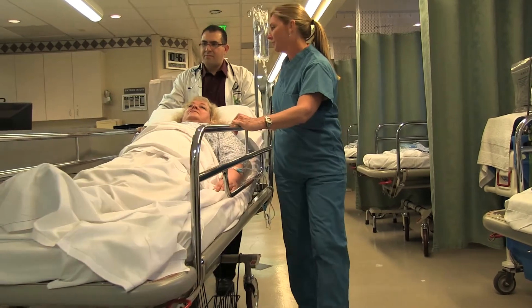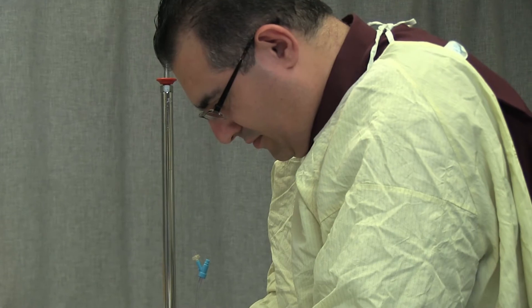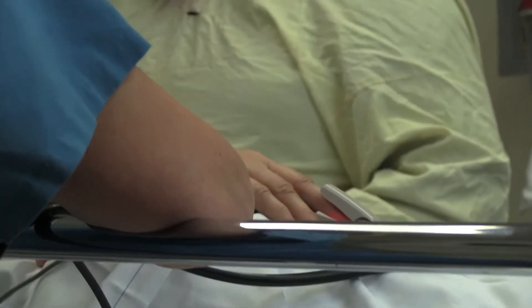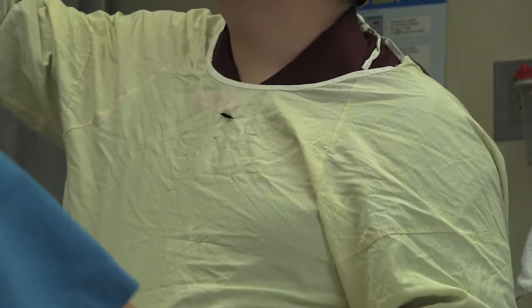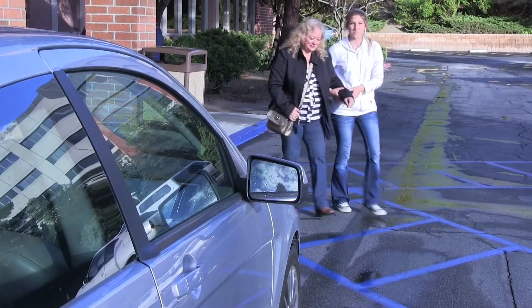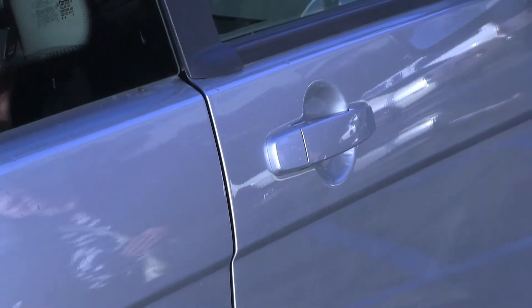How is EGD performed? EGD is generally done under sedation in an endoscopy center or at the hospital. It lasts approximately 5 to 10 minutes. During EGD, if I see something that may be abnormal, I can perform a biopsy or removal of a small amount of tissue for analysis. In many cases, EGD allows accurate diagnosis and treatment without the need for a major operation. After the procedure, you may have mild cramping and you will need to have a ride home as you will not be able to drive. Here are instructions to prepare you for an EGD.